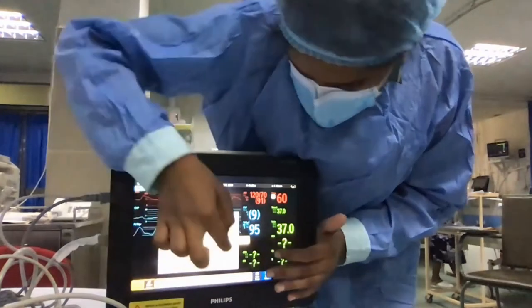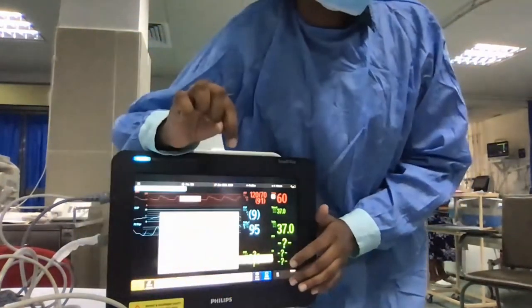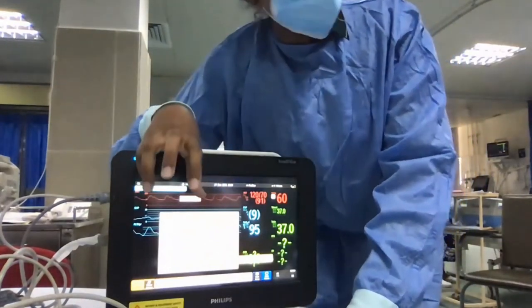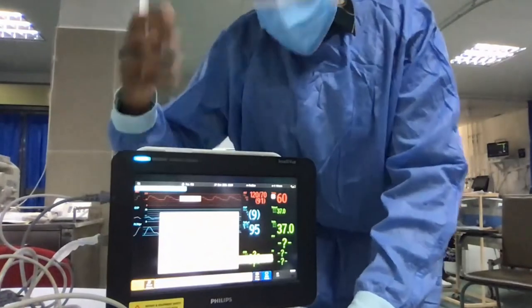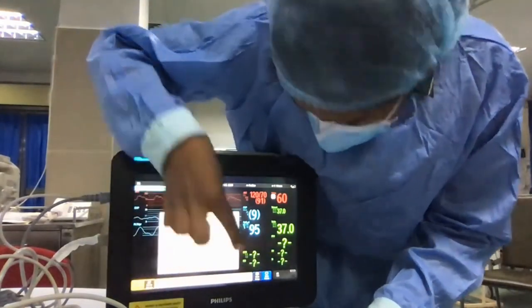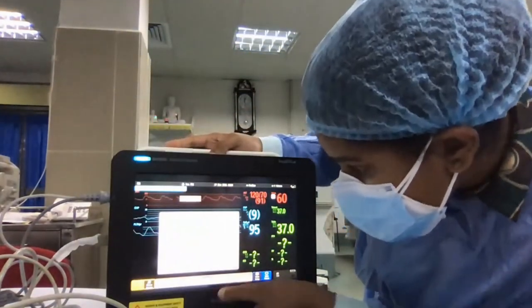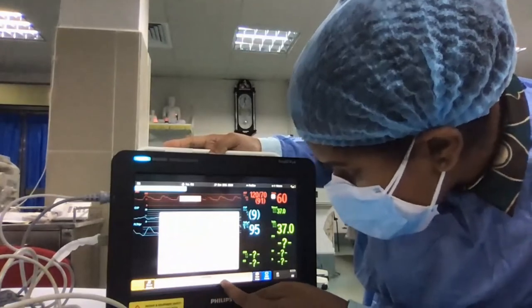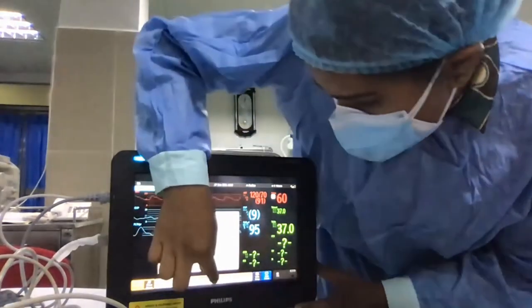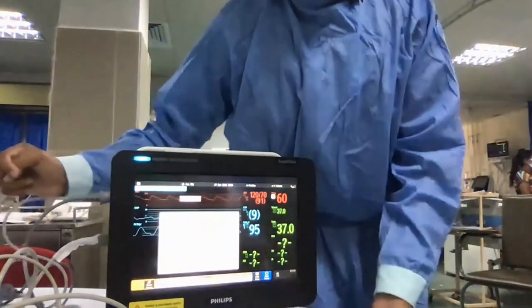So for example, EVLW, it's extravascular lung water index. So you can see that. And if you can't remember the normal ranges, we can't keep everything in mind, no? So you can select, where is it? The on-off ranges. Exactly. So the normal ranges will be displayed here.